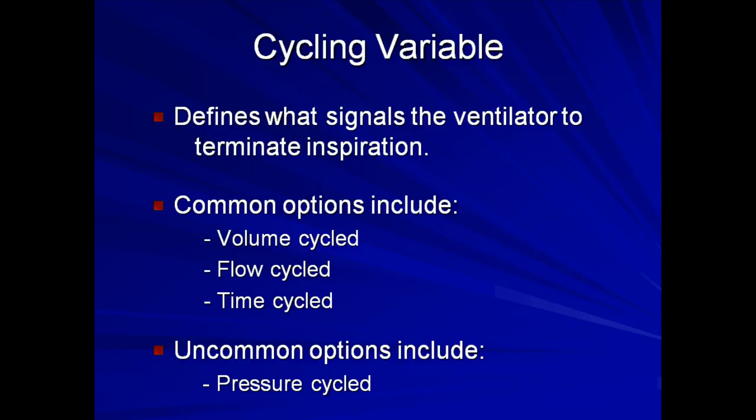The cycling variable has some overlap with the control variable, and as I mentioned already, the two are frequently used interchangeably, although some would say this is incorrect usage of the terms.